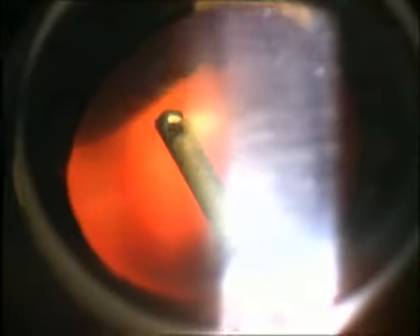Thus we ask for a precise aspirating flow control. We ask for a quick and efficient cut, without pulling out or moving the retina. And finally, we ask for a stable intraocular pressure during the entire procedure, and so we want the machine to adapt its infusion flow to the aspiration flow.